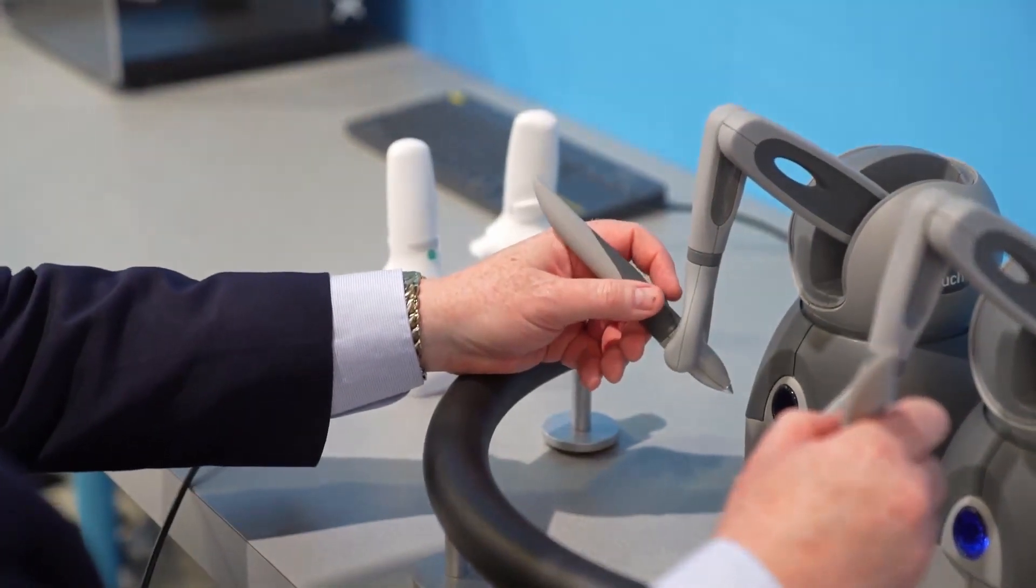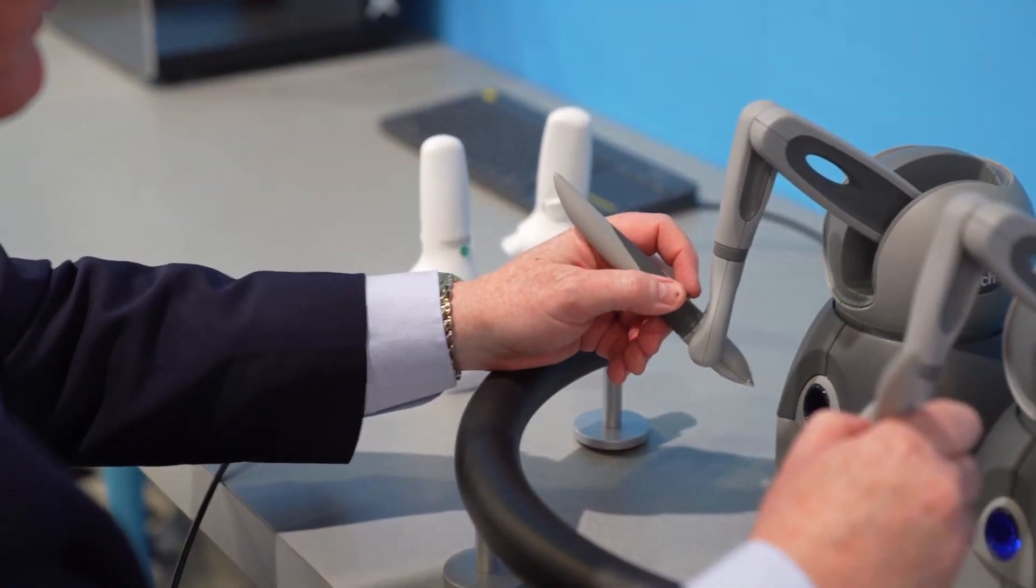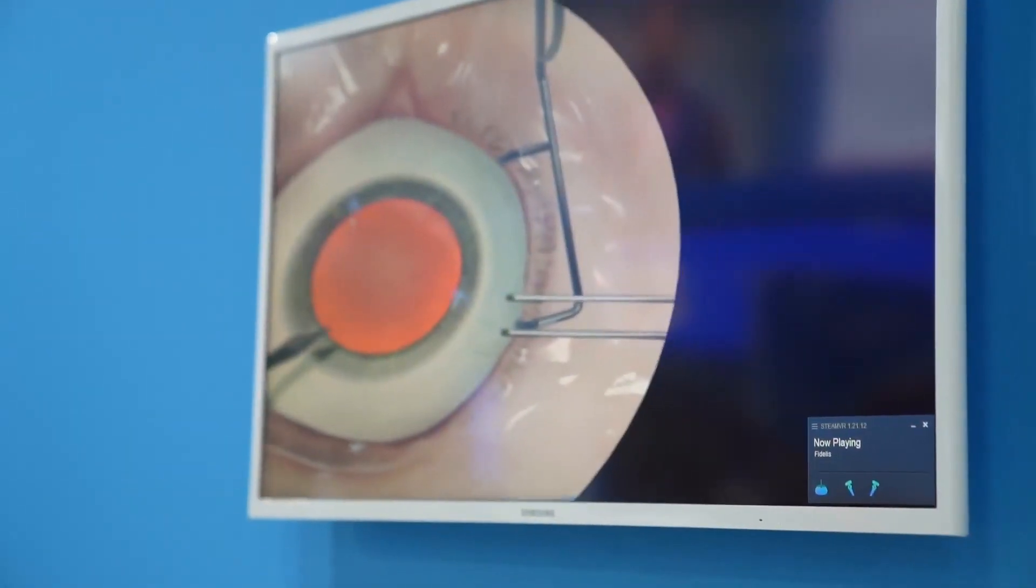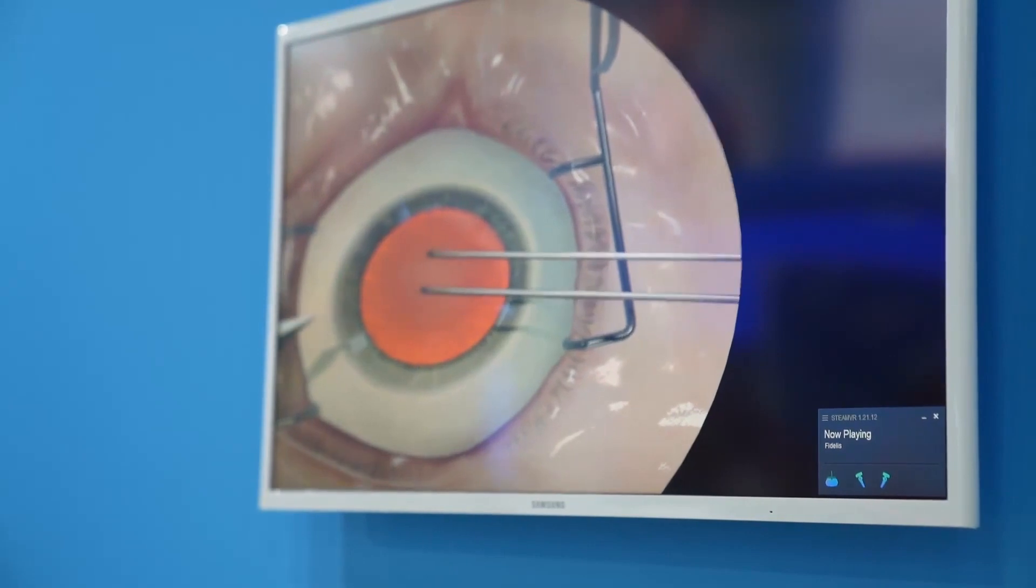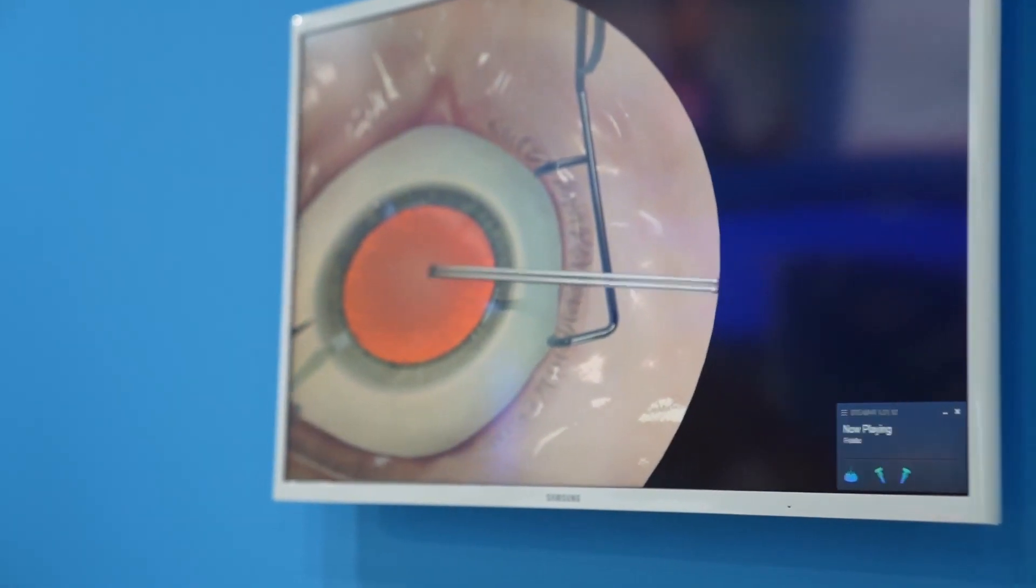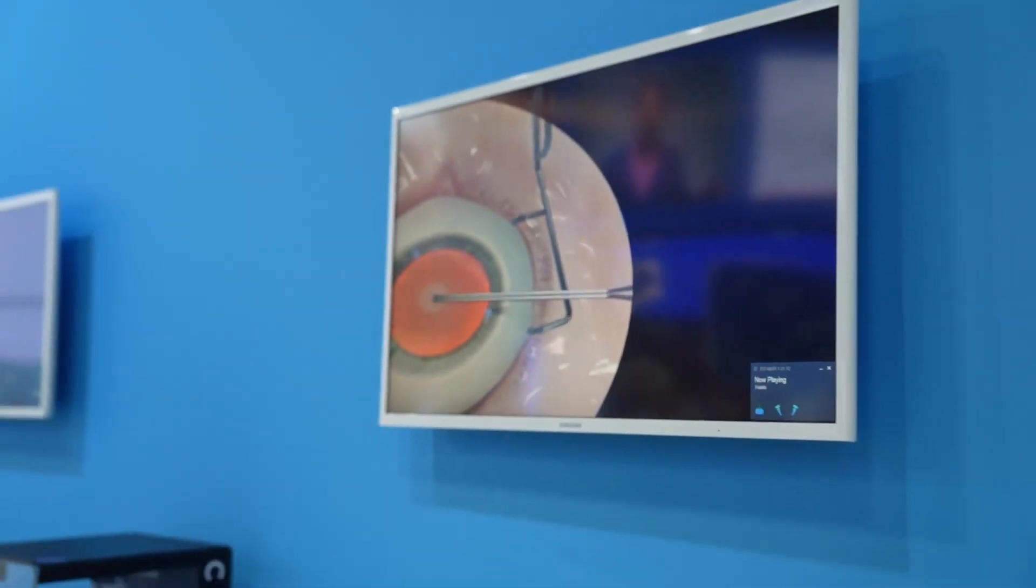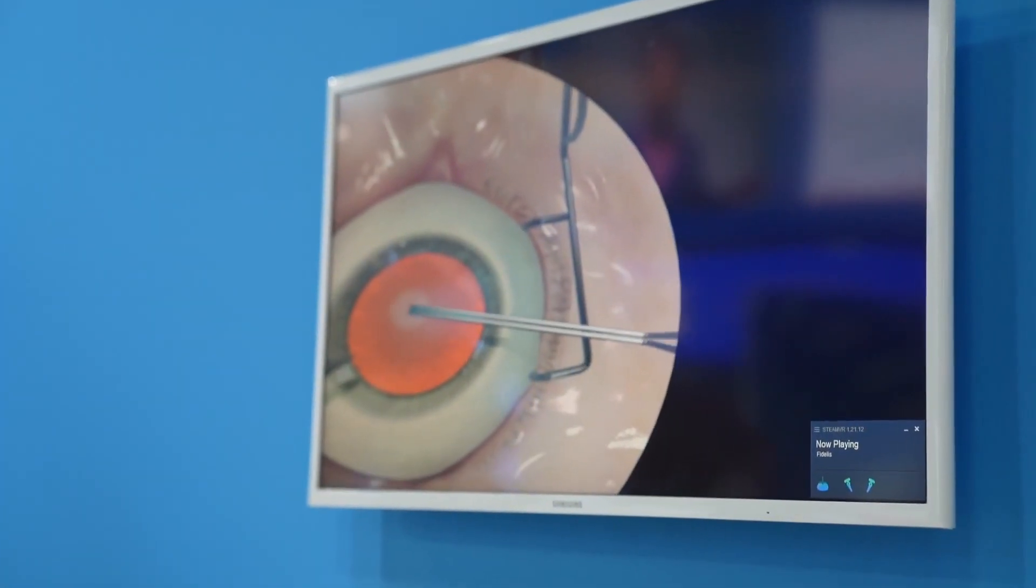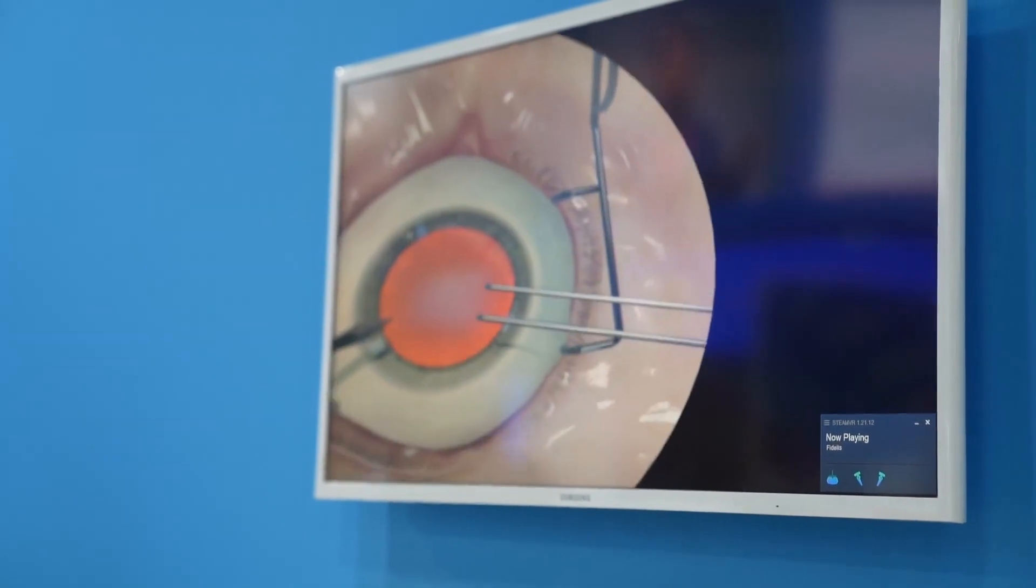What's interesting about Fidelis is that we have haptic feedback, meaning that I can feel resistance in my hands as I'm manipulating the instruments and going through the different steps of the procedure. You can see here that I'm applying pressure to the top of the cornea. I can feel that resistance in my hands as I'm applying that force.